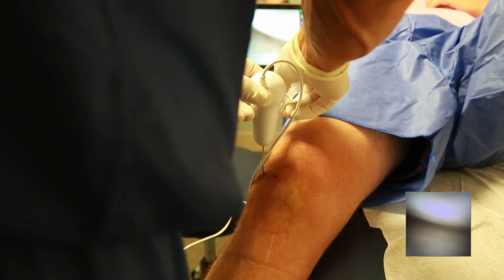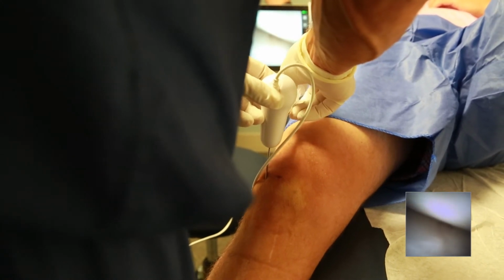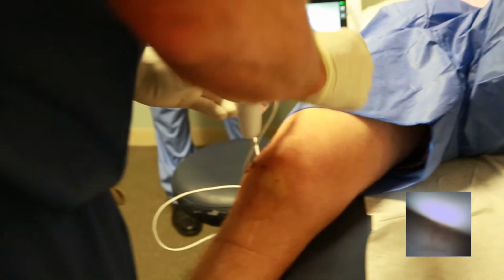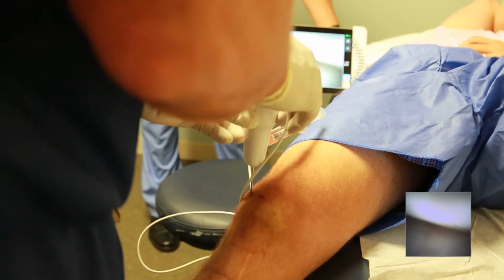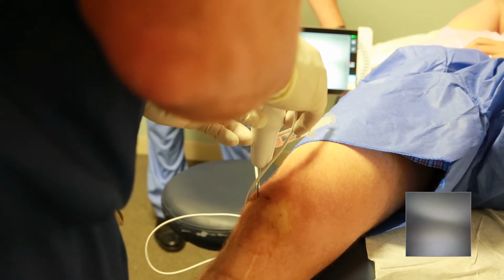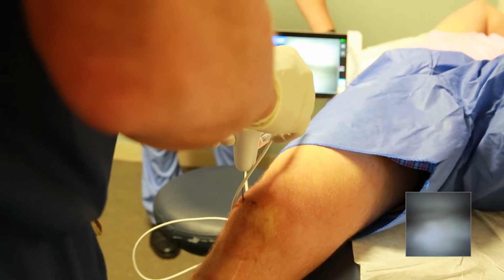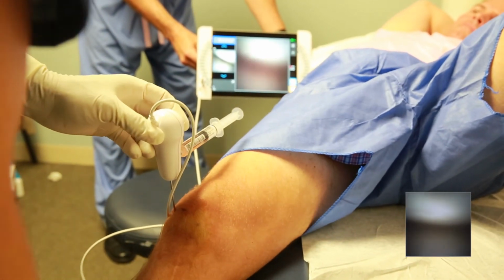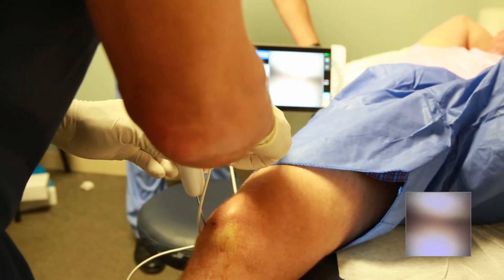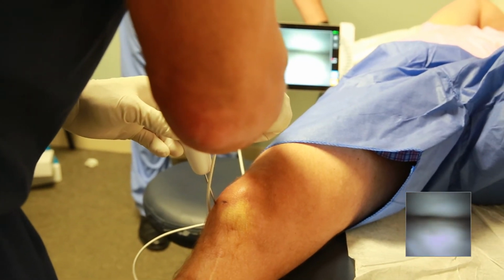And then we'll see your meniscus right here. So there's your meniscus. You see a really good picture of your meniscus there. Now you see we're having a little trouble seeing this posterior horn right there. If I put a little bit of force on there, he's got that debris in there. Just relax your leg. There we go.